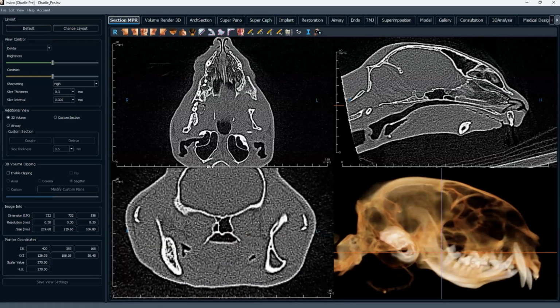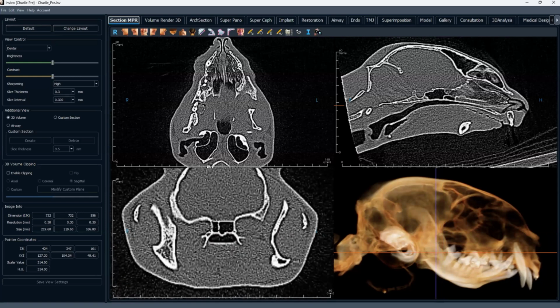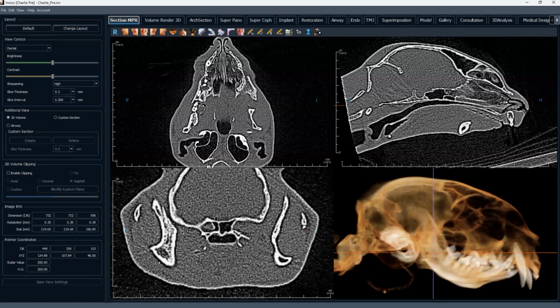It's still a fairly normal looking mandible. And then we get into the area that's probably injured, where the healed injury was, and the normal architecture and anatomy just goes away. So on the left side, this all looks pretty normal. We're getting into the coronoid process. We still have a mandibular canal.